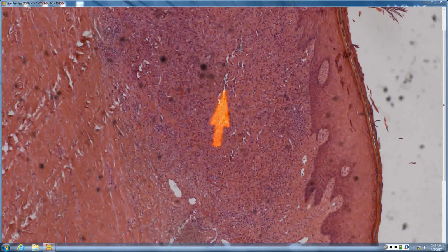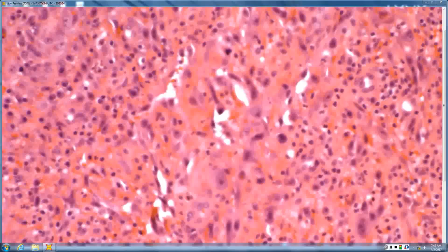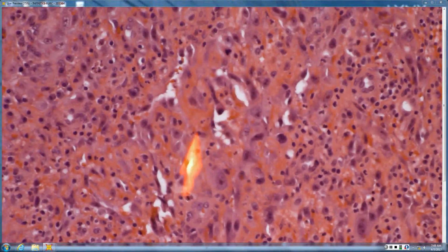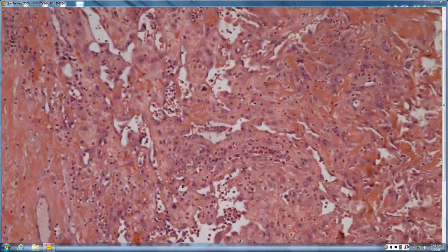with large hyperchromatic nuclei in the lumen. It's like angiosarcoma. So angiosarcoma: dissecting crack-like vascular spaces. You may or may not identify any blood in them, but you do have hyperchromatic hobnailed nuclei. In the hobnail hemangioma, you had hobnailed nuclei that were pretty much normal in size. These are big, ugly, hyperchromatic hobnailed nuclei in jagged, crack-like, irregular spaces in the dermis. So angiosarcoma.